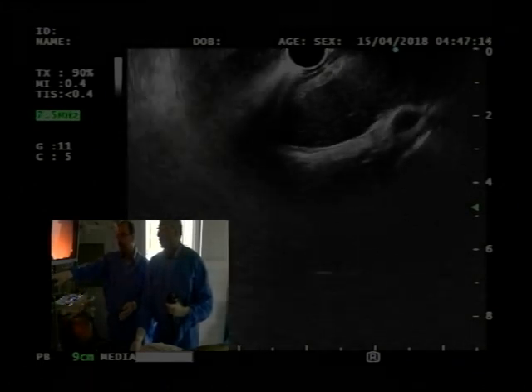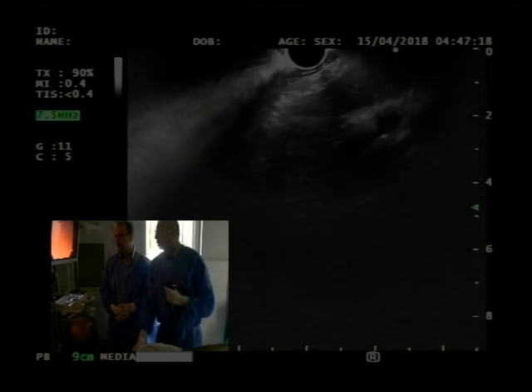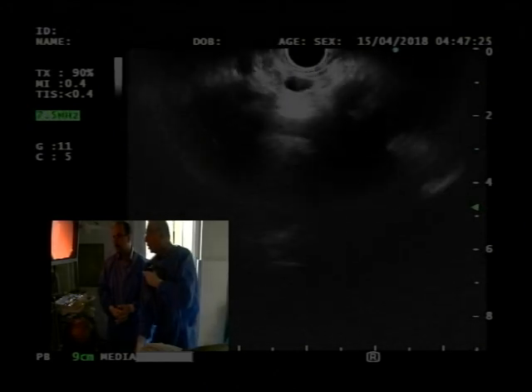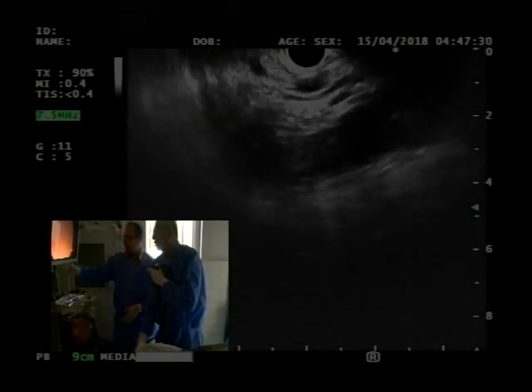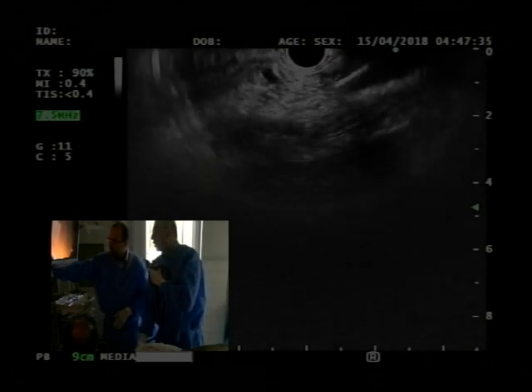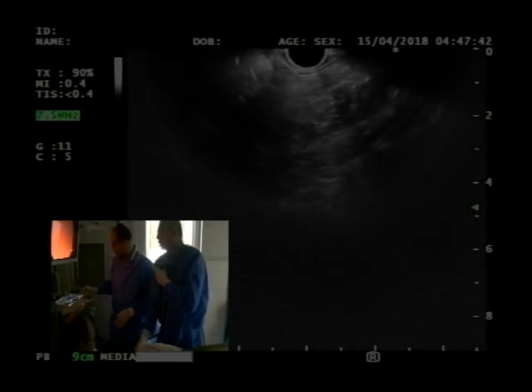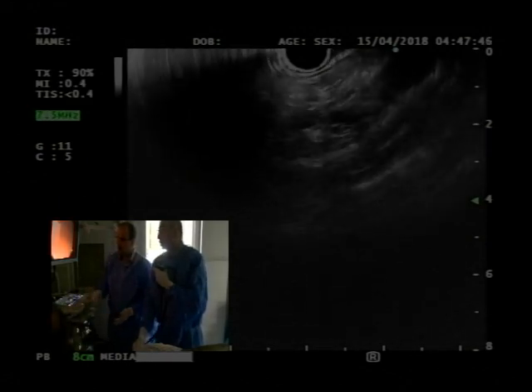There you go. Now you have liver. And if you go clockwise, you start seeing liver. If you keep going clockwise, and now, what's the structure? Right again, right? Now go counter again. Go counter. And that long tubular structure. Right. So pull back a bit for a second and so go clockwise.